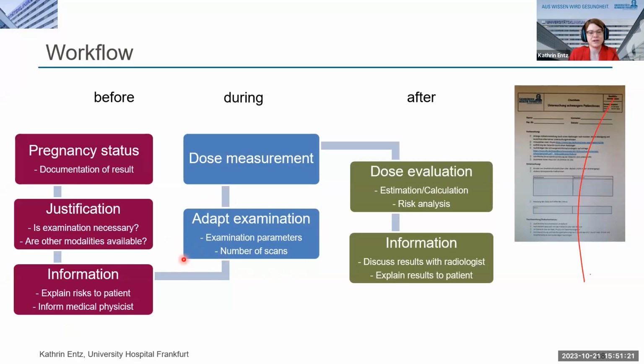If you're doing the examination, adapt the examination parameters, try to lower the dose if it's possible. Don't do it on your own if you're the medical physicist. Always talk to the radiologist. So as a team, discuss what is possible.